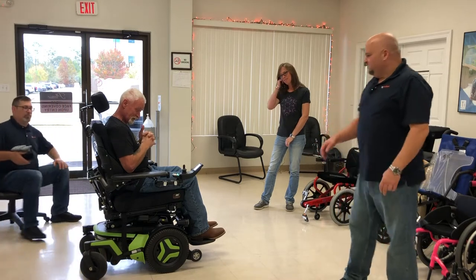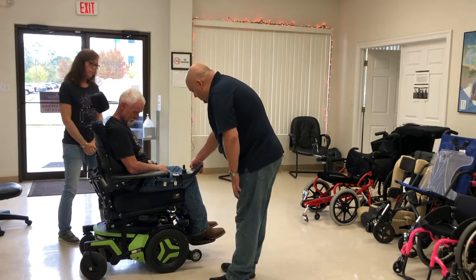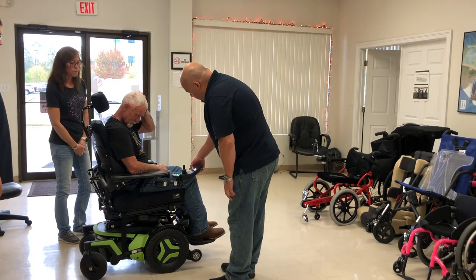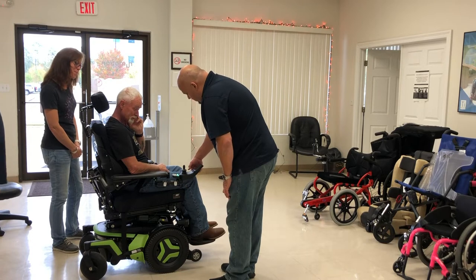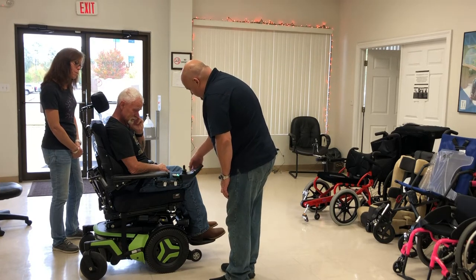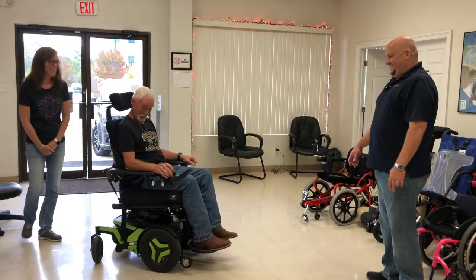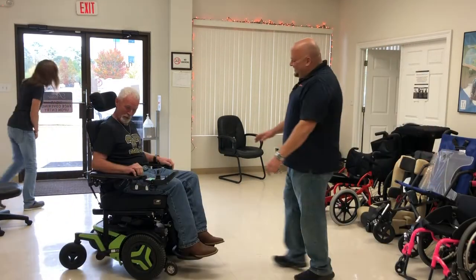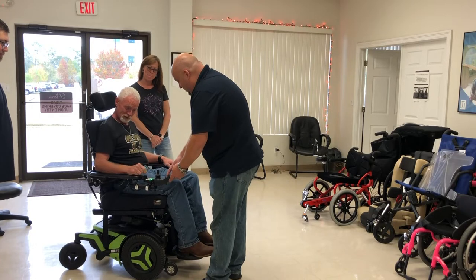Let's take it for a spin! This is where you turn the chair on — this lever right here. Right now you're in indoor mode, which is programmed at an indoor speed so you're not going to fly through the house — no bumper cars. If you hit it to two you're in normal, that's your mid-speed. Hit the rabbit all the way and now you're at the fastest speed.